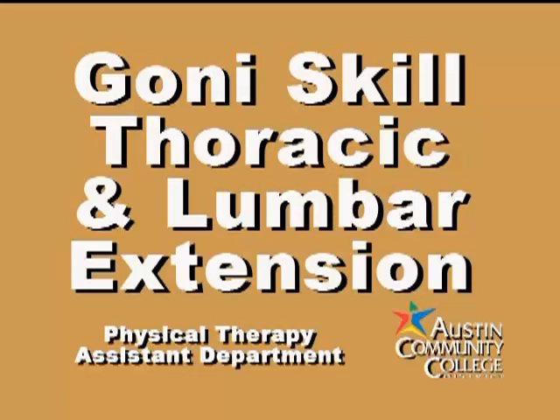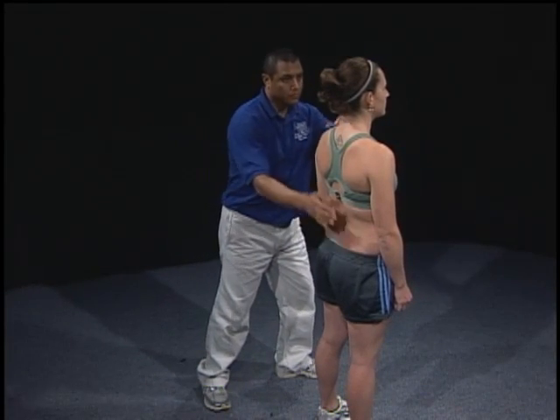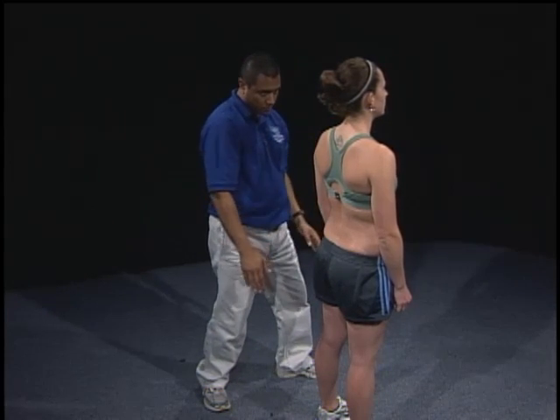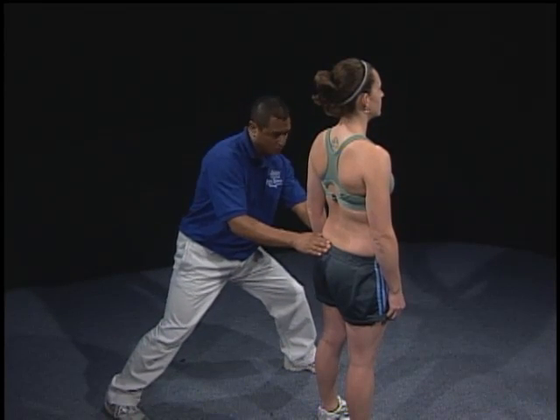Goniometry: Thoracic and Lumbar Extension. Position the patient in standing with the cervical, thoracic, and lumbar spine in 0 degrees of lateral flexion and rotation. In patient-appropriate language, ask the patient to extend the trunk as far as possible.